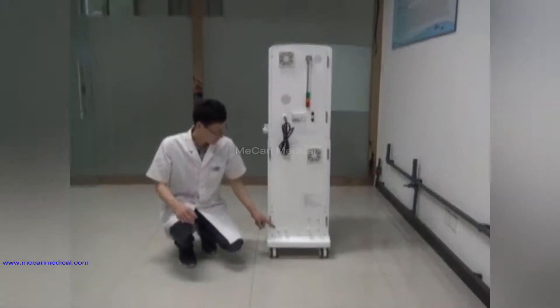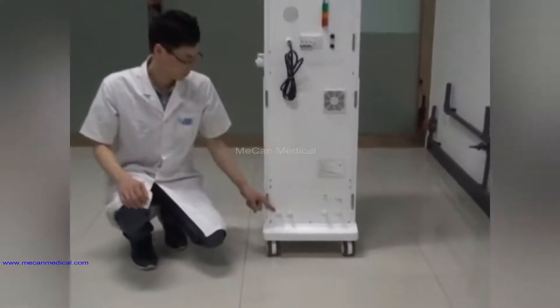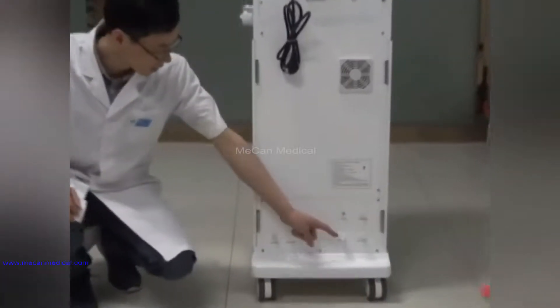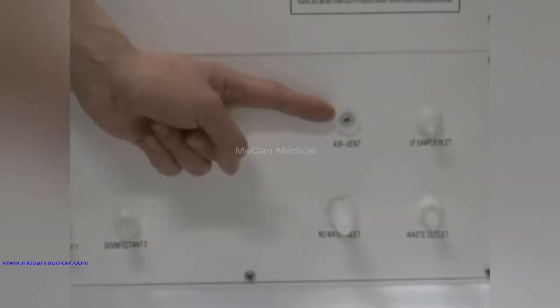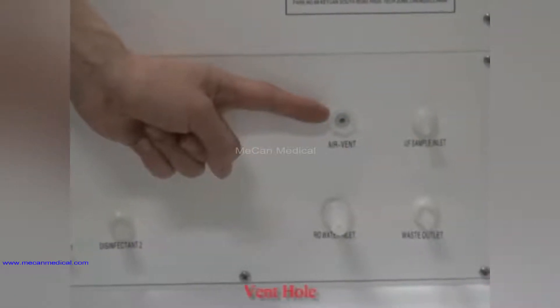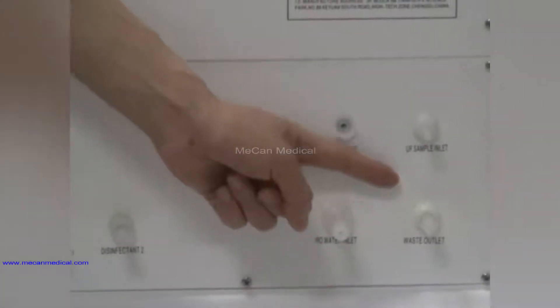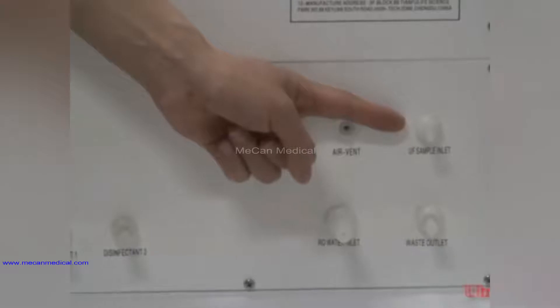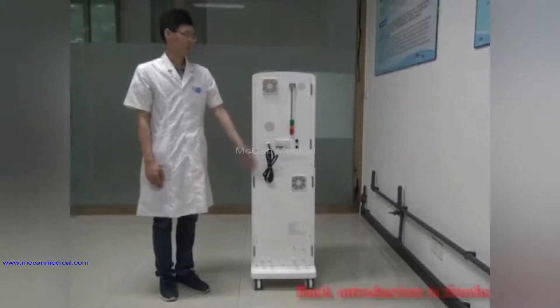On the back there is also the disinfectant suction inlet, RO water inlet, vent hole, waste outlet hole, and ultra filtration sampling port. Back introduction is finished.